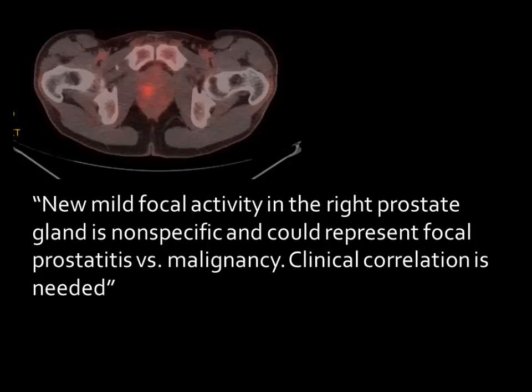Finally, here's a scan with a common incidental finding on PET, some focal activity in the prostate gland. The description of the report said new mild focal activity in the right prostate gland is nonspecific and could represent focal prostatitis versus malignancy. Clinical correlation is needed.